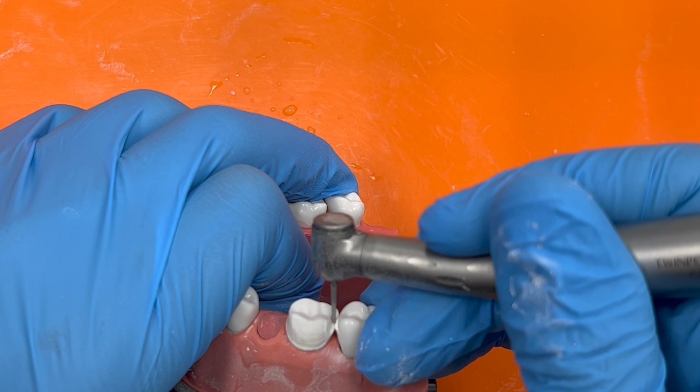Now, I use a 245 straight burr for occlusal reduction. I start by reducing the grooves, keeping the burr angulated along the slope of the occlusal surface, until the burr seats completely, indicating 1 mm reduction.